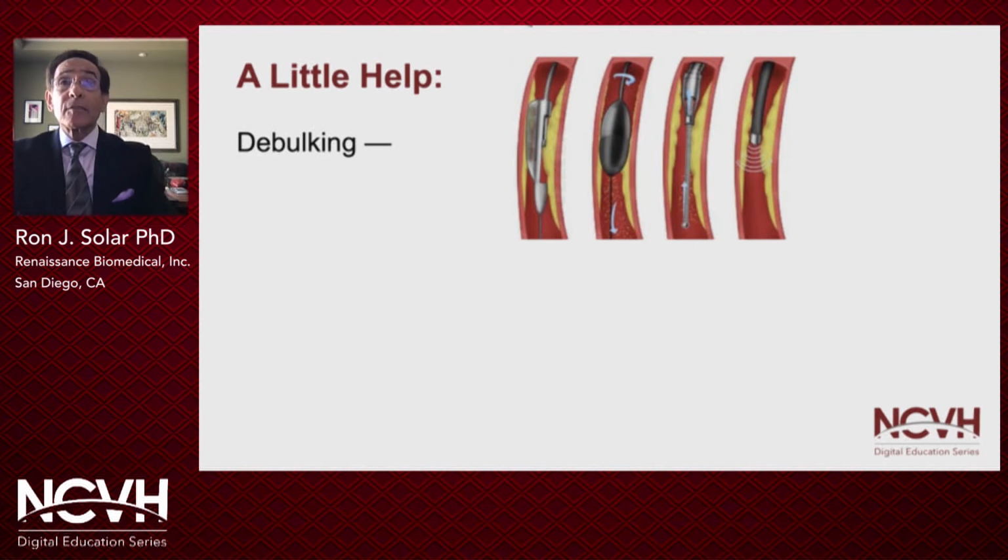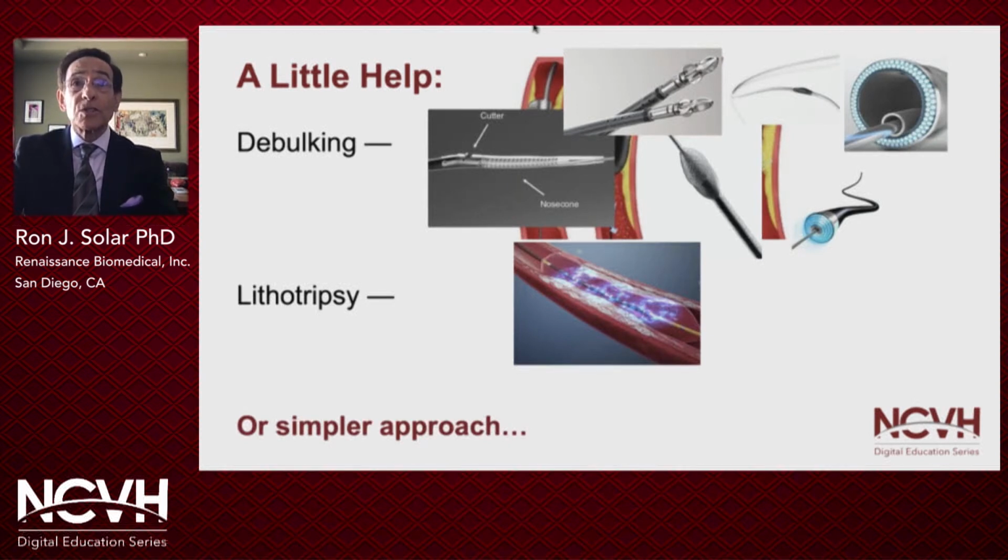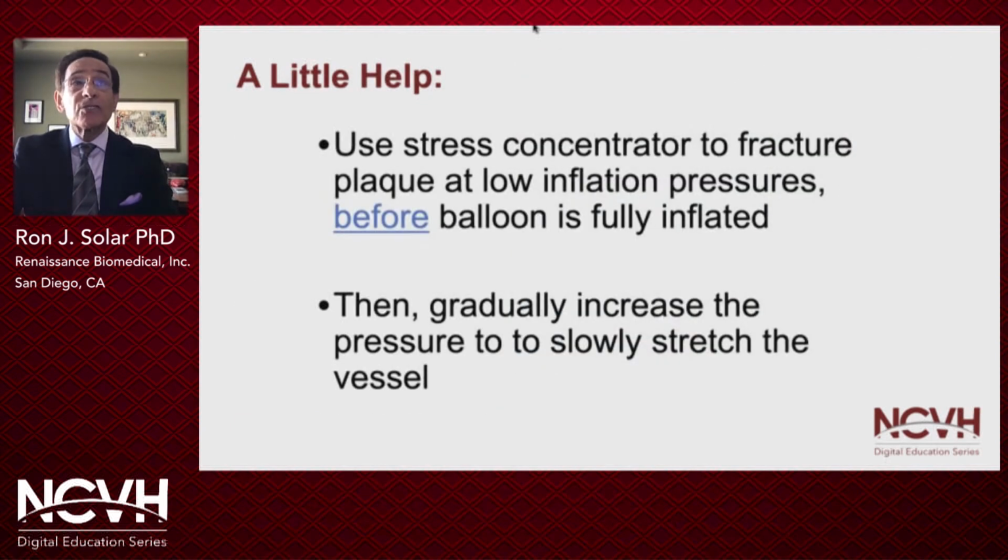You can also crack the plaque with shock wave to change the compliance of the lesion. And this is also shown to be very effective. Or you can take a much simpler approach. And that is, you can use a stress concentrator to fracture the plaque at low inflation pressures.